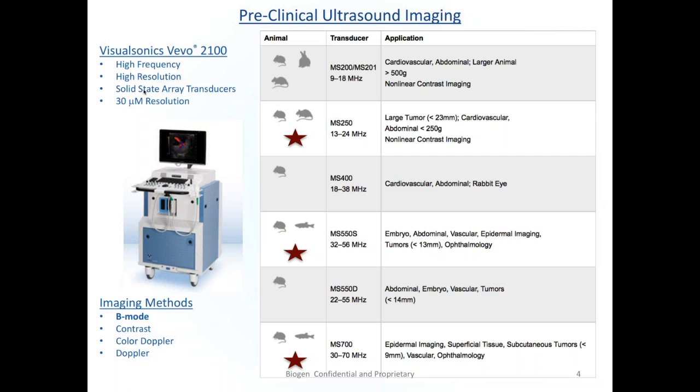Because of our applications, we purchased the 3 different transducers shown here with the stars, and for all of the studies I'm going to tell you about today, these were done with the MS700.